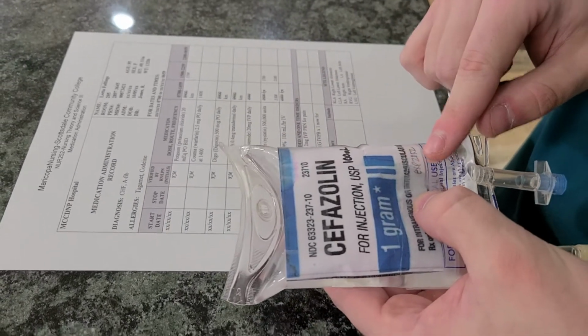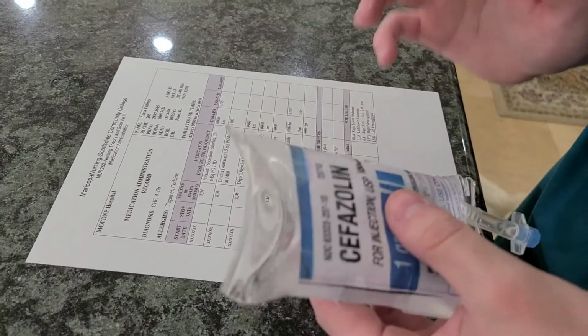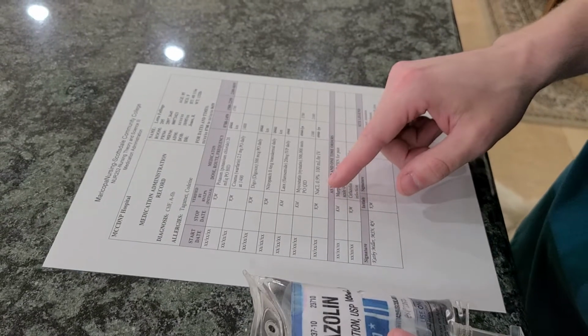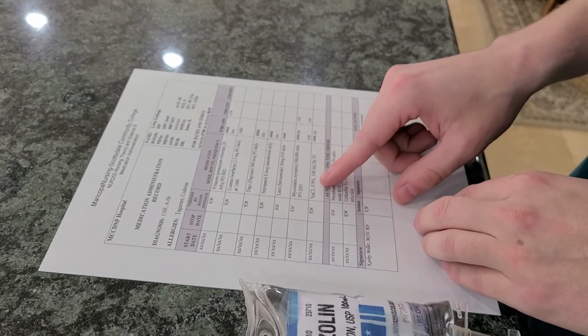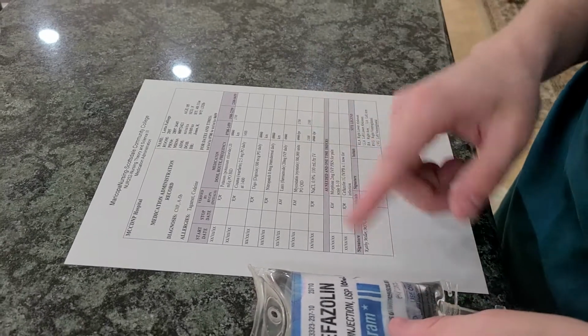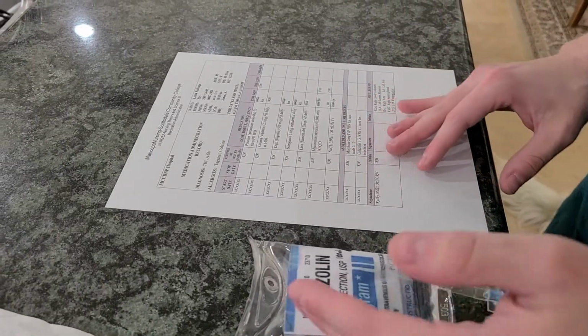The medication is not expired, it expires in 2052, and it is a 100 milliliter bag. So we did our second check, everything's good. I also see that we have normal saline, 100 milliliters an hour IV hanging already. I checked and it is compatible with cefazolin, so it's good to give.